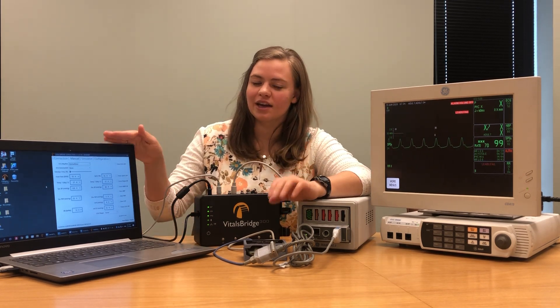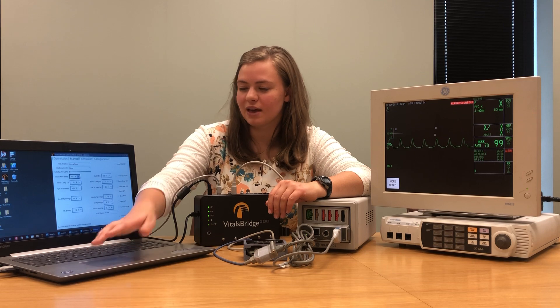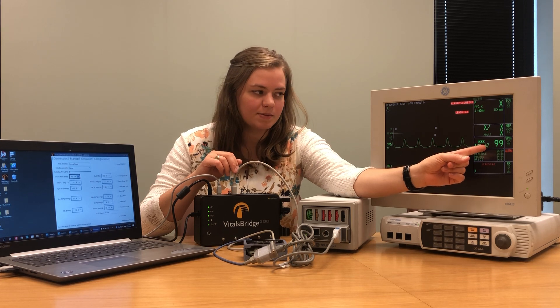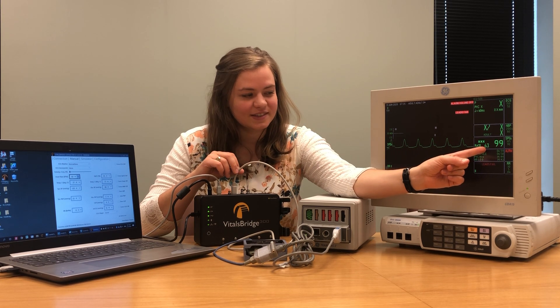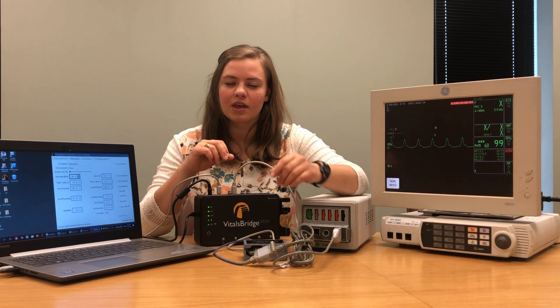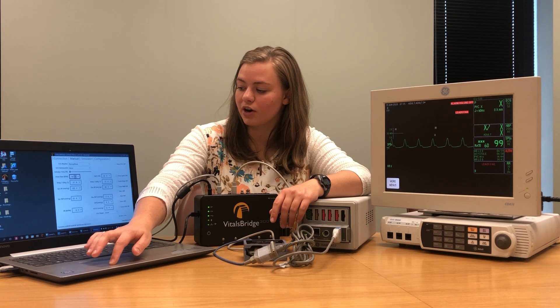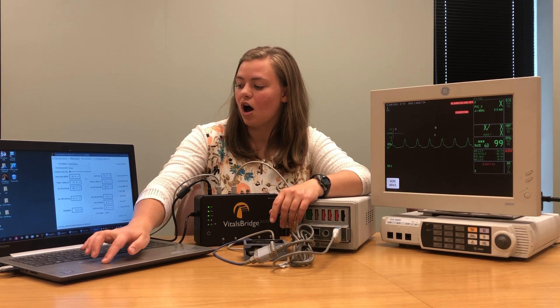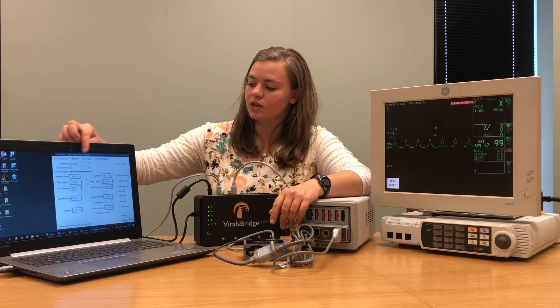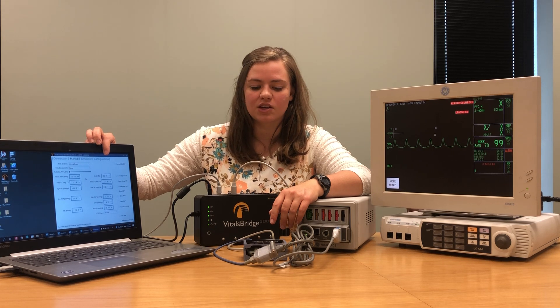Just to make sure that our controls are working, I'm going to come here to the connector software and drop my heart rate — I'm going to pick 60. Notice how the heart rate on your patient monitor also drops down to 60 beats per minute. It looks like everything's working well there. You can also test this function with the SPO2 saturation level. One thing to note is that the SPO2 saturation level shown on your patient monitor may not match what you have on your connector software — that's okay, it's a really easy fix.